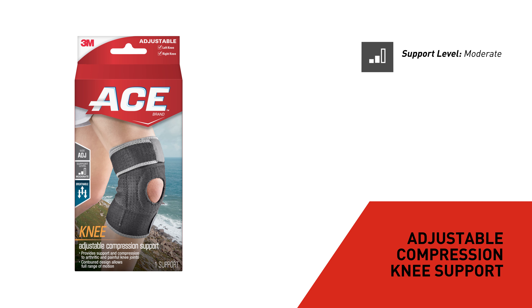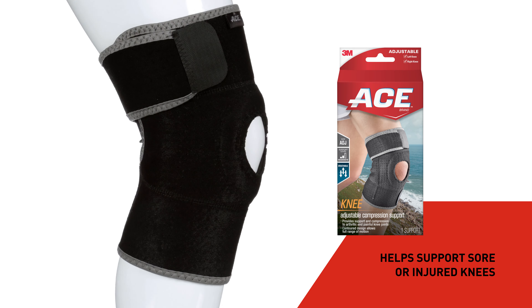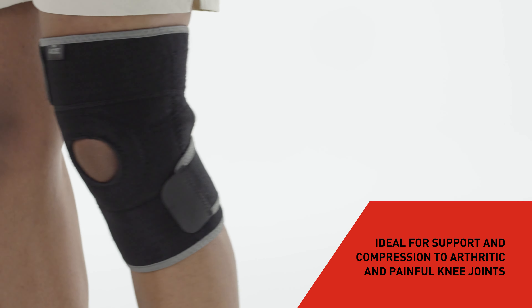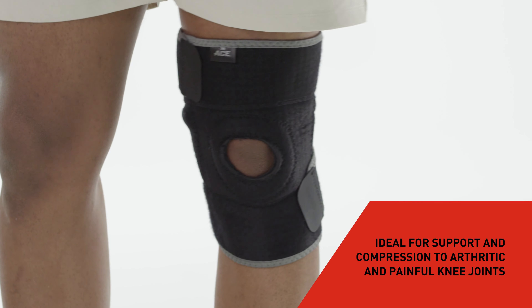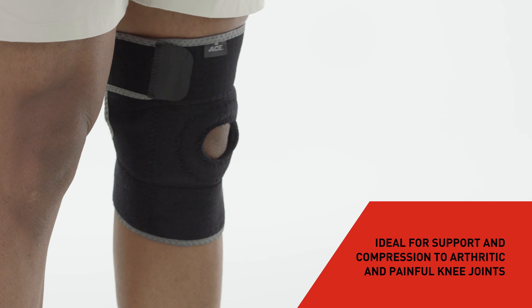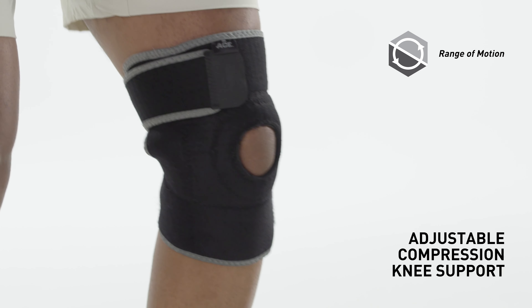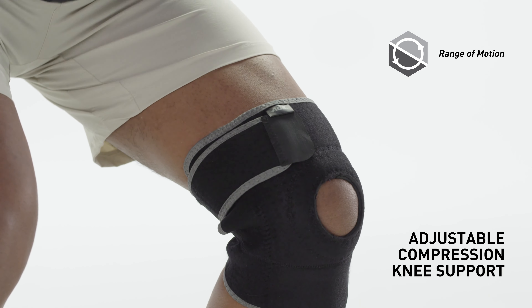ACE brand adjustable compression knee support helps support sore or injured knees, ideal for support and compression to arthritic and painful knee joints. The comfort sleeve helps prevent chafing on the back of the knee, and the flexible contour design allows for full range of motion.